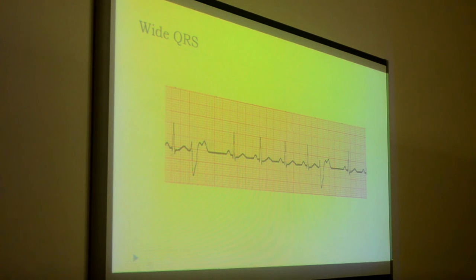Look at this. If we start from the beginning of the patient data, then we go through the three R's, the rhythm. The rhythm here seems regular, but then all of a sudden you've got this irregularity here and this irregularity here. Another thing you have is, here it's sinus, the relation is fine, the heart rate here is fine, but then all of a sudden here it is not sinus, there's no clear P wave coming before. Okay, what about the QRS complex here?